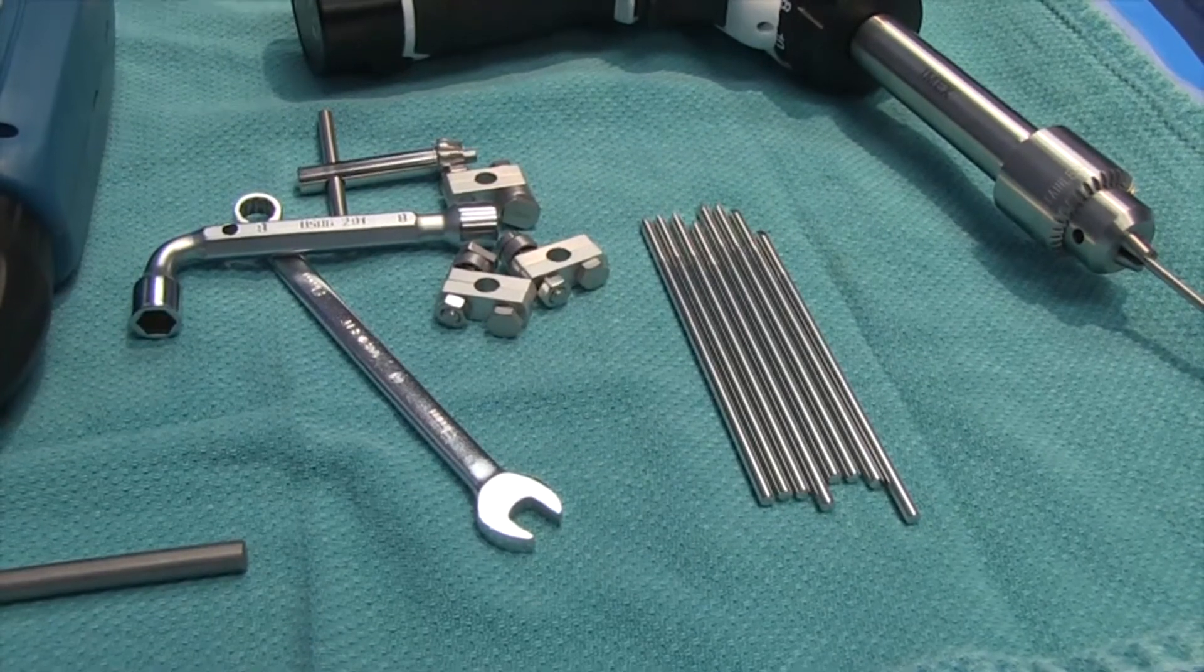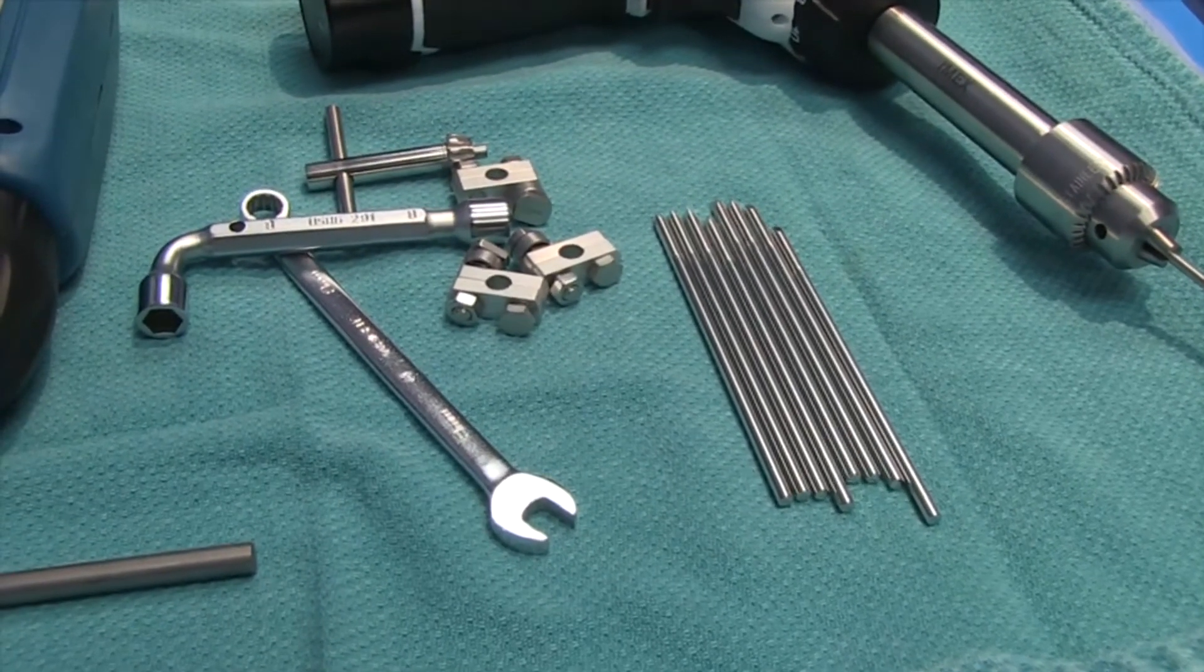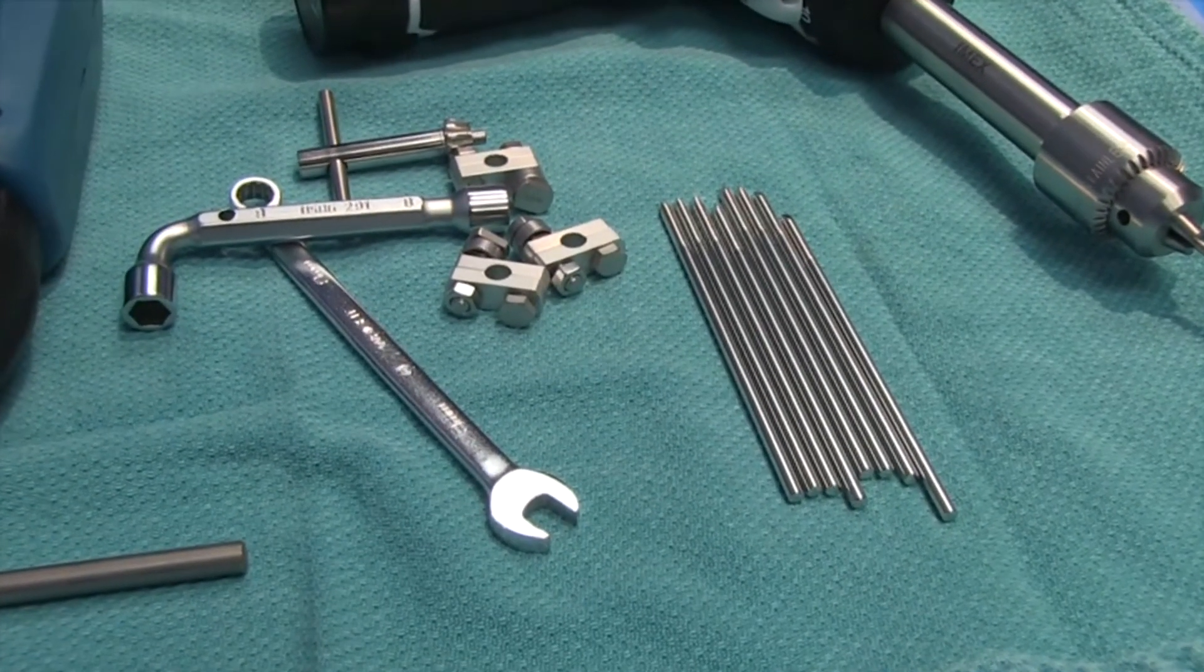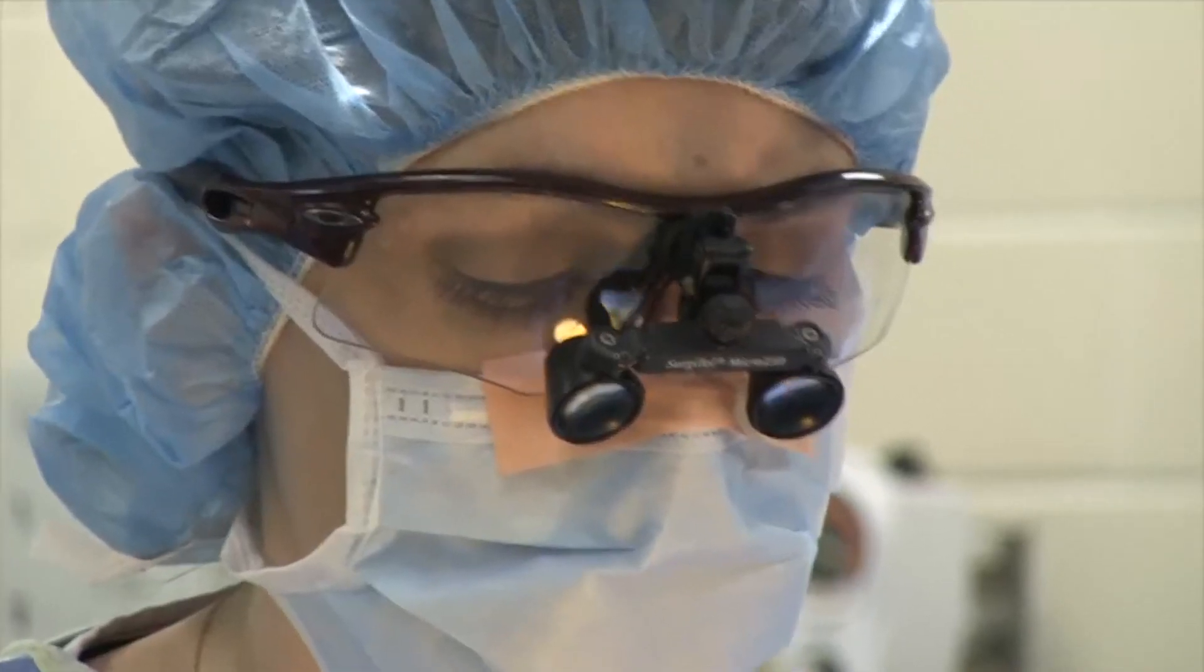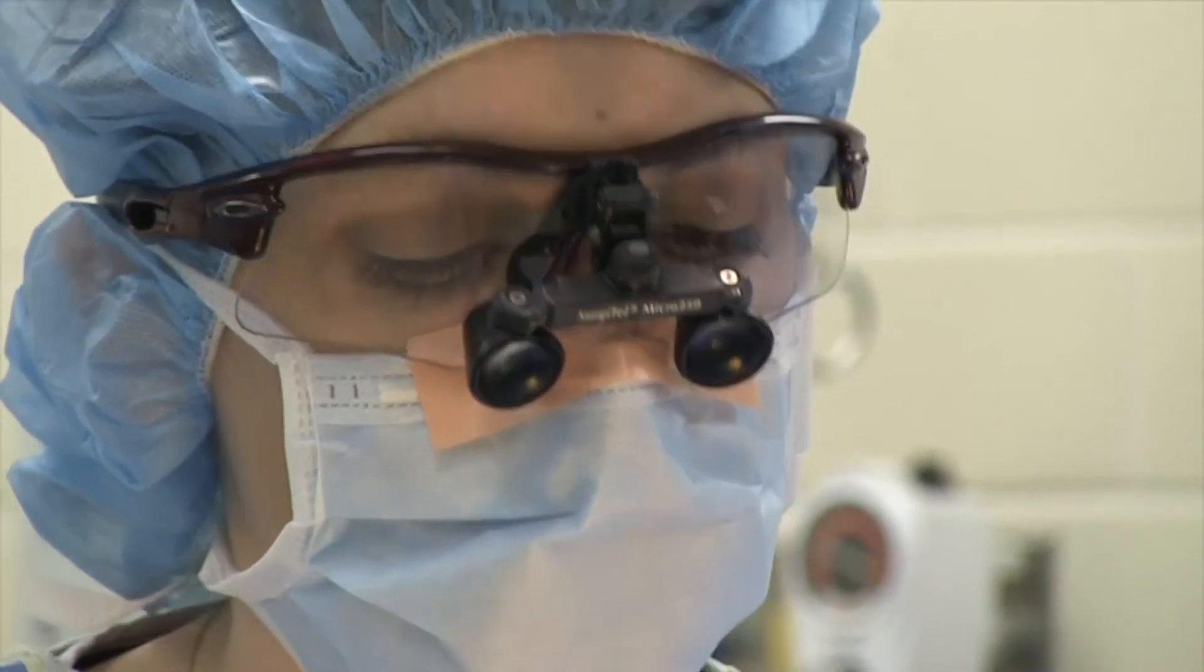Of all mechanical veterinary external skeletal fixation devices, the SK fixator requires the least instrumentation while providing the surgeon the most pin diameter options.